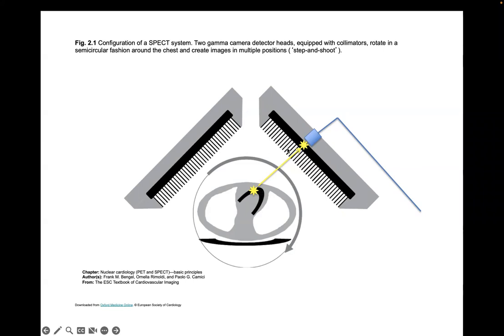And this set of detectors is aligned in this straight line projection such that if I have an event over here and it goes straight towards the detector, I'll detect it at this point on the detector. So you want a projection of the patient onto this angle.